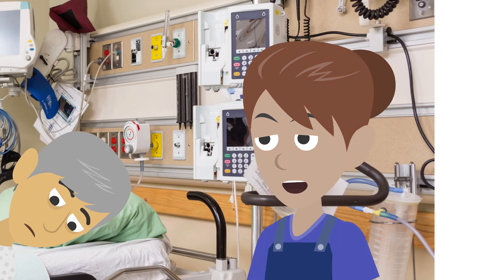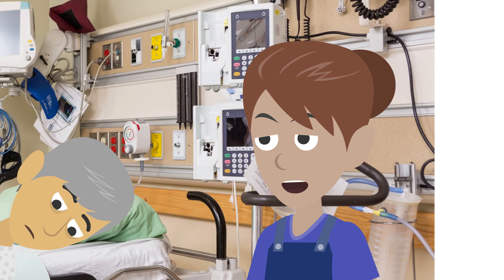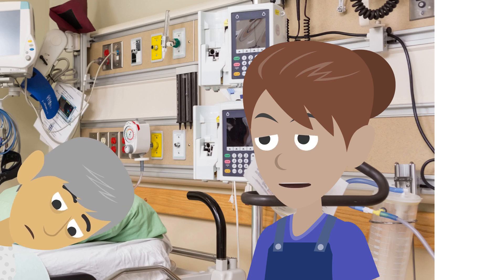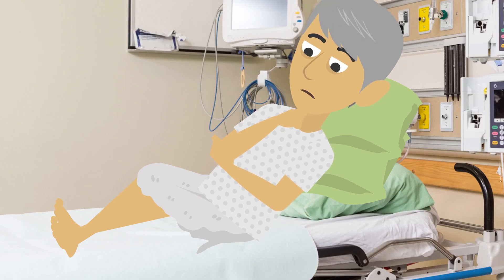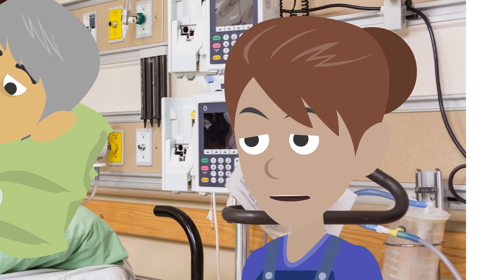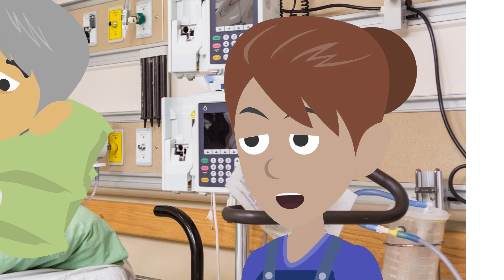Now I'll help you to sit up in bed. I'll put some pillows behind your head for support to make sure your head doesn't tilt forward or backwards. Now I'm going to measure the tube from your nose to your earlobe and breastbone and add a bit extra as I explained before. I'll just take note of the mark on the nasogastric tube so I know how far to put in the tube.